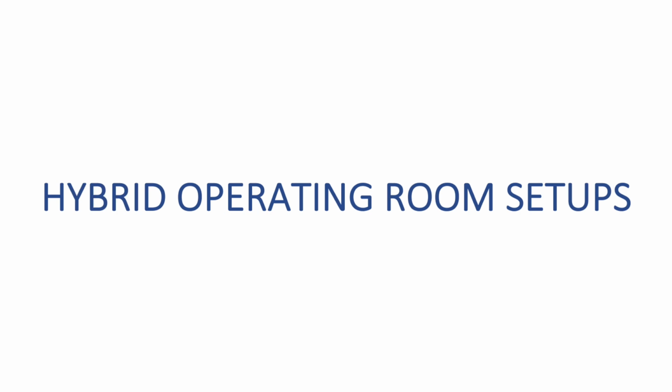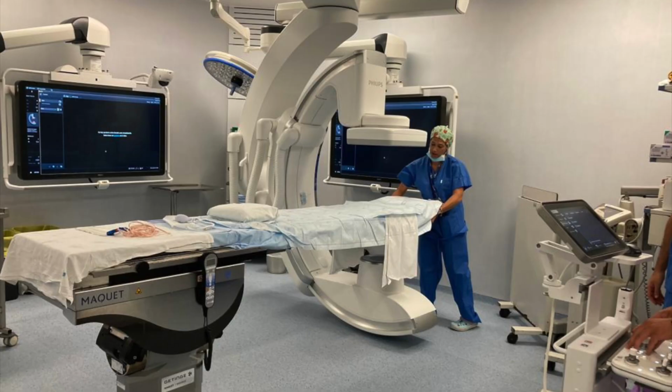Hybrid operating room setups. It is essential that the patient is consistently positioned to standardize procedures and maintain the anesthesia workspace in a fixed location. This ensures that positional adjustments required for each procedure can be made only by moving the C-arm and surgical table.